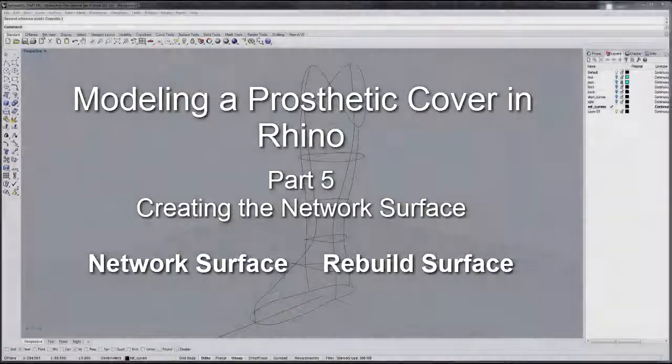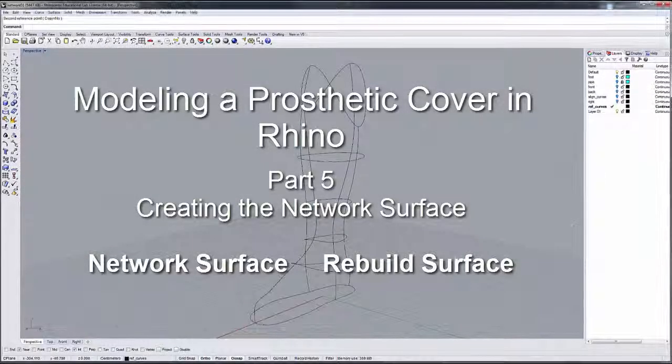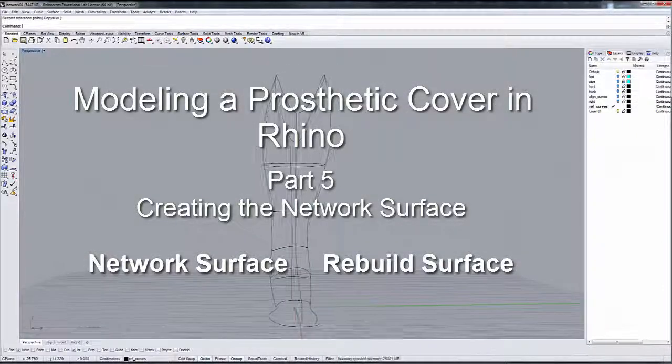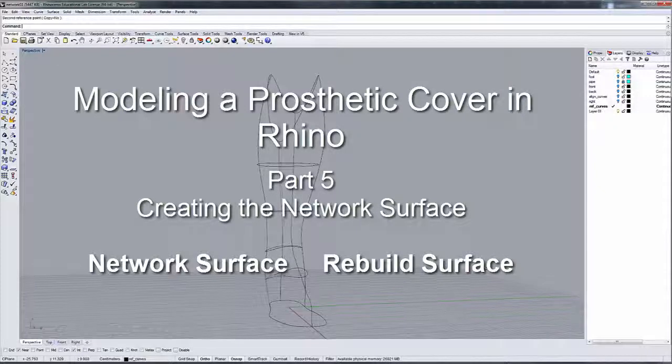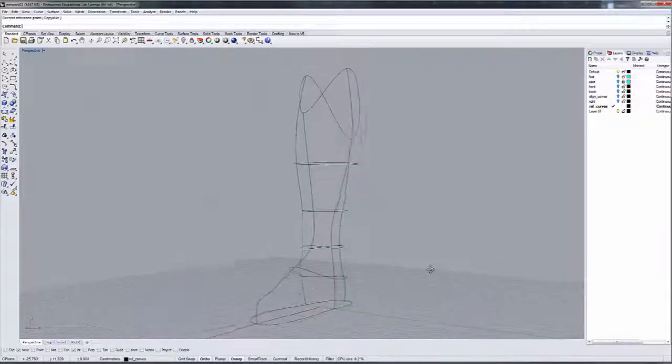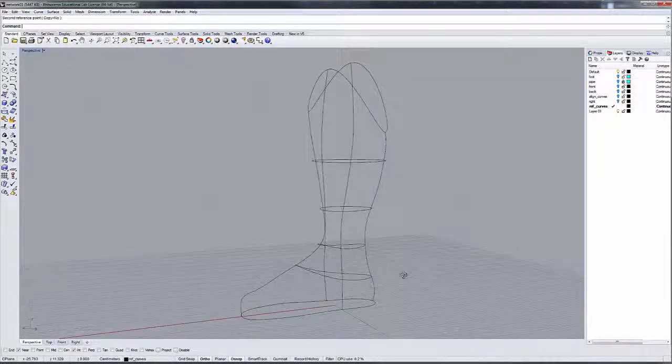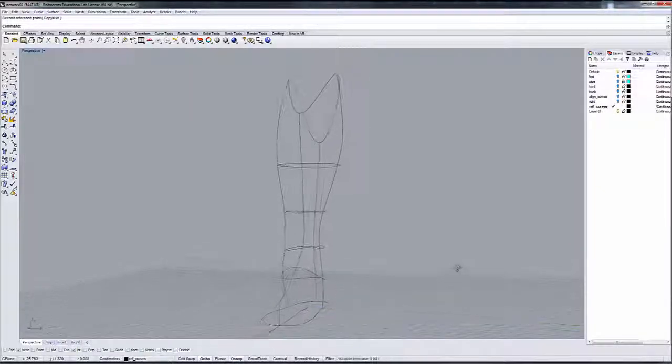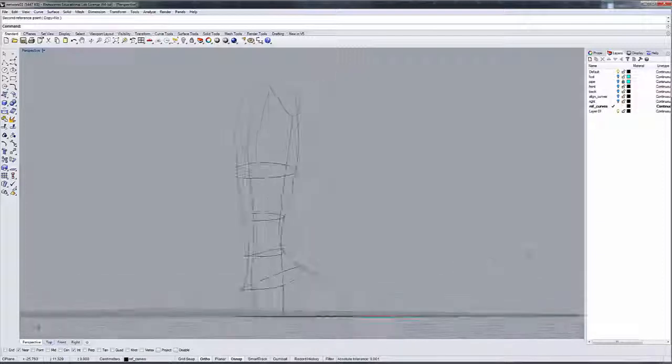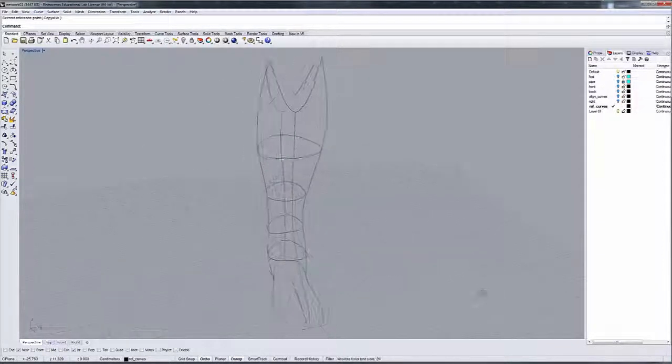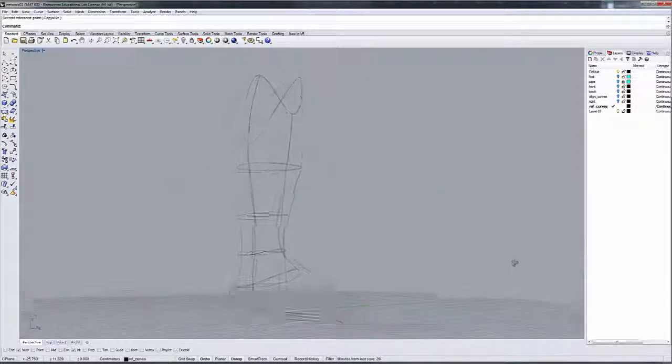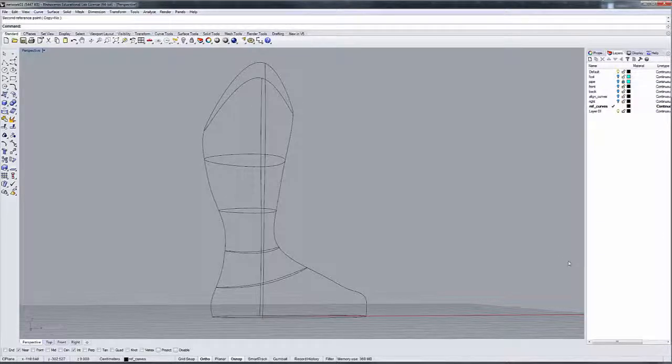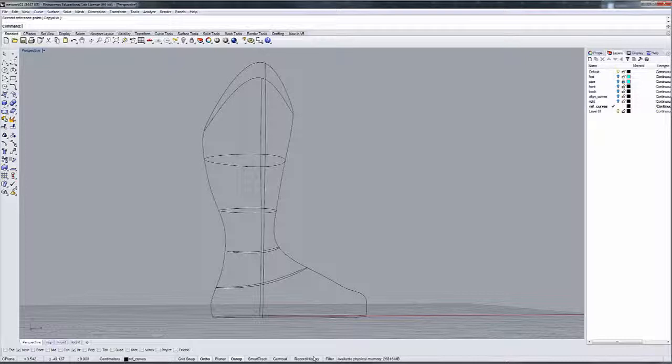Okay, we're going to create our network surface, which we're going to use to create our boot last. What we're going to do is actually leverage our record history command to allow us to refine the initial shape.